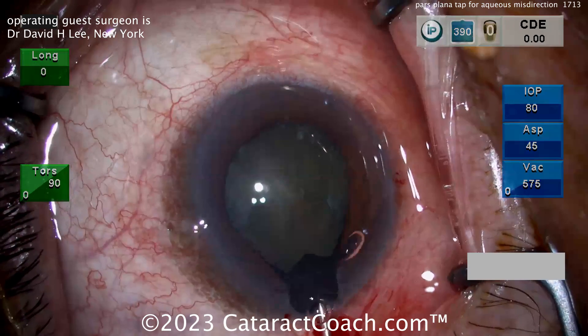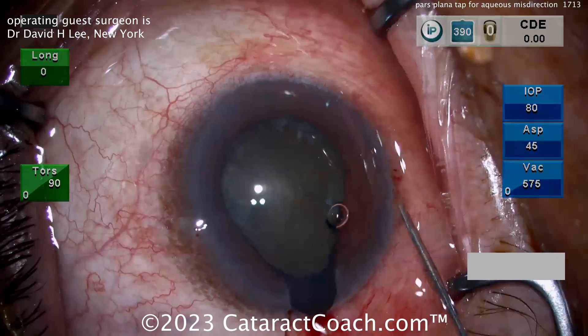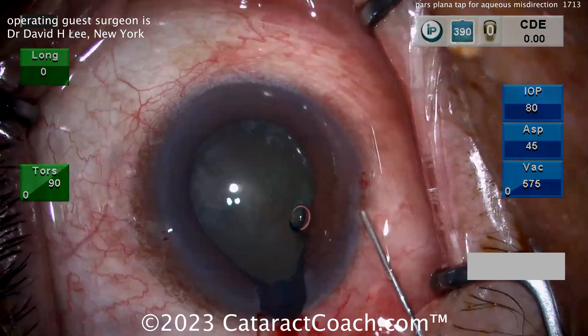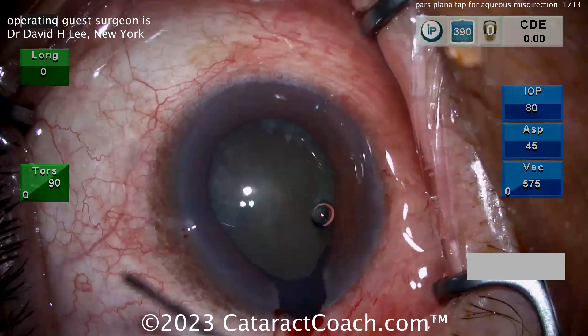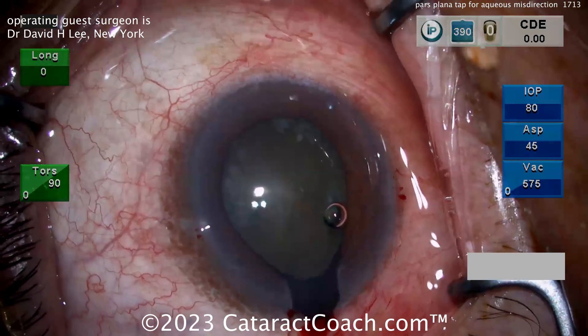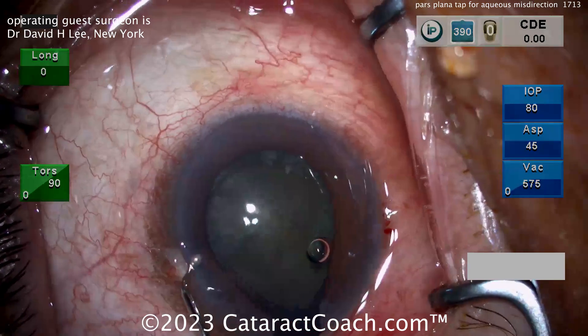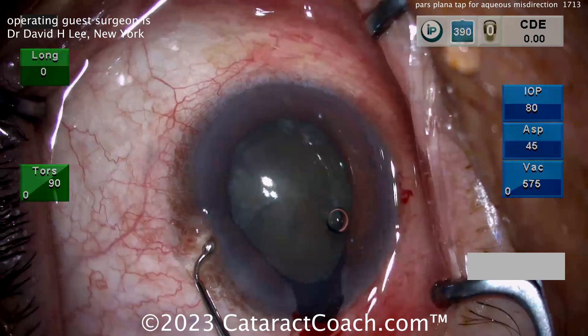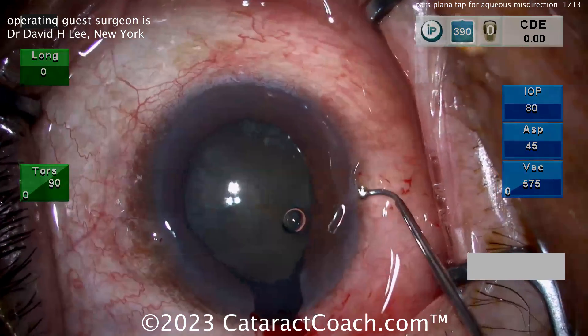The main question here is: where is the pressure gradient? Is there high pressure in front of the posterior capsule or behind it? If it's in front of the posterior capsule, you can have a case where you do the hydrodissection and there's a fluid trap between the back of the nucleus and the posterior capsule. In that case, simply rock the nucleus back and forth to release the trapped fluid — it will resolve this.